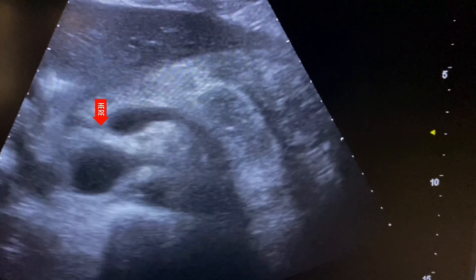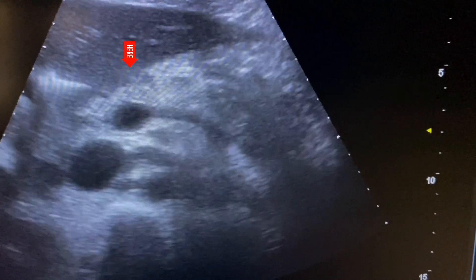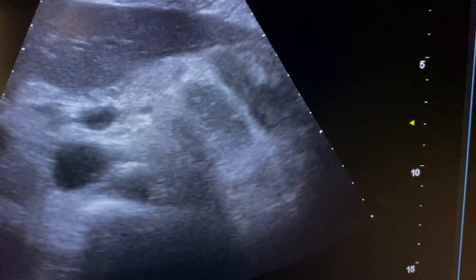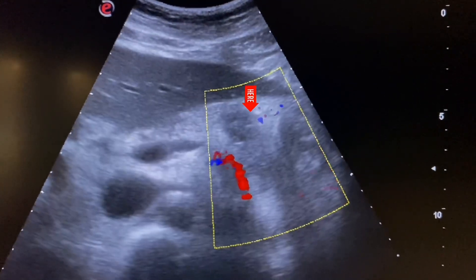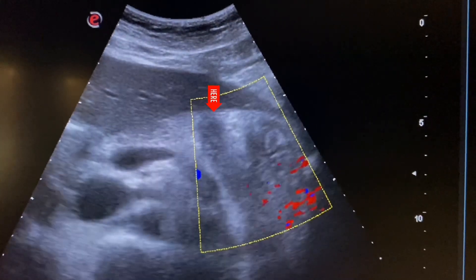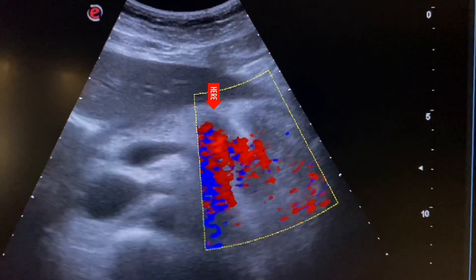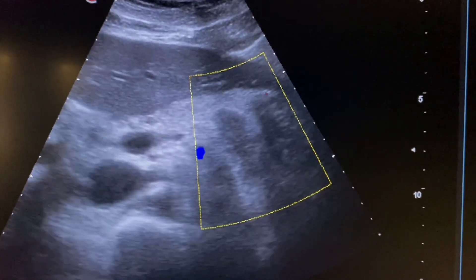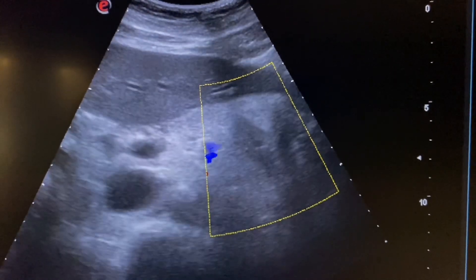Now we see the uncinate process and the head and neck of the pancreas, which are echogenic and normal. On color Doppler, we see no flow in the heterogeneous area.